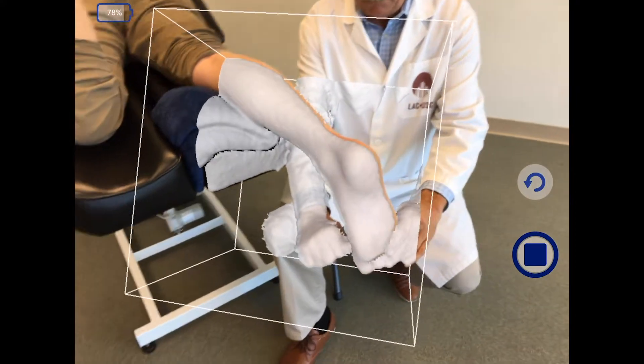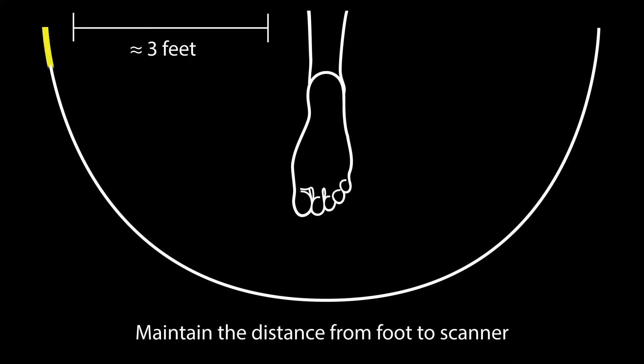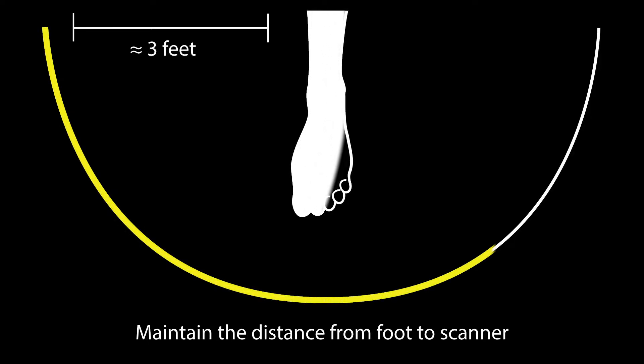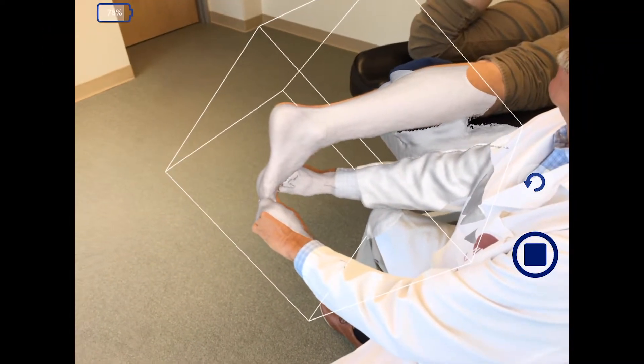Then move around the foot in an arc, maintaining the distance from the foot to the scanner. When the required anatomy is completely painted in white, tap the square to stop scanning.